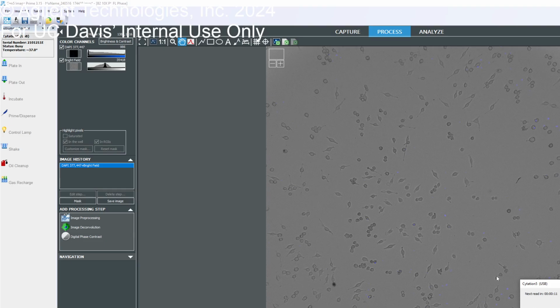Let's take a couple more images and then. Yeah. Because I also want to show you how that video would look and how you can access those images. Maybe let's let it go through the third start.